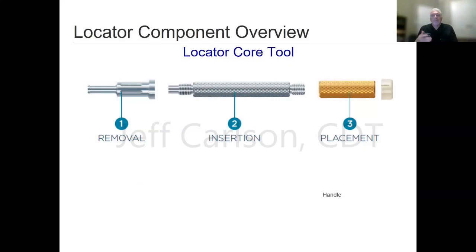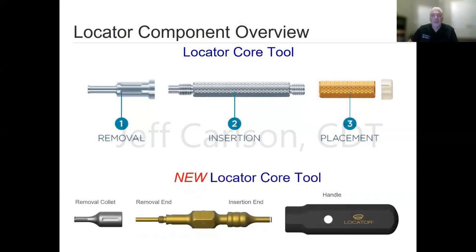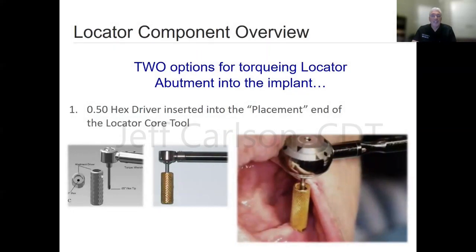So hopefully you all know this tool has been around for quite a few years now. They used to have just that little hook one, but now there's a new one as well. And this is going to be a useful tool when it gets into their new fixed locator that I'm going to share with you at the end of the presentation. Again, just be current with this information, I mean, with the instrumentation.